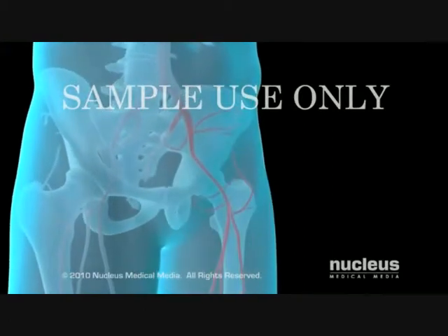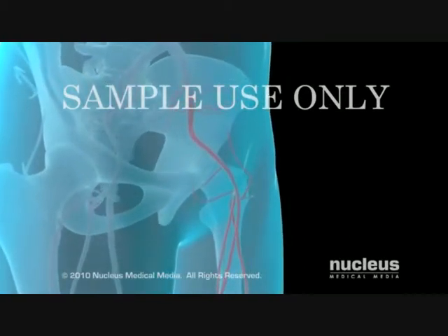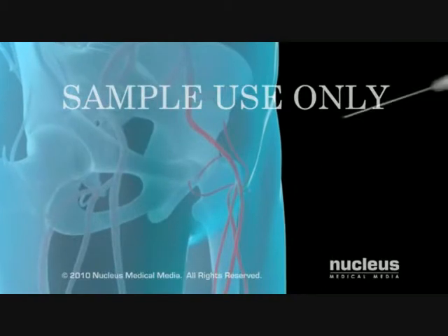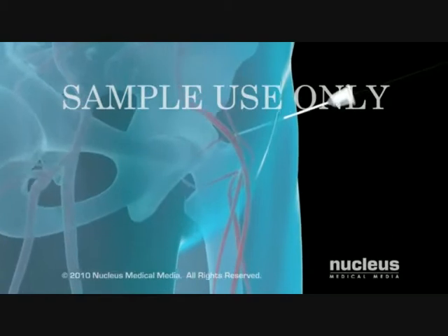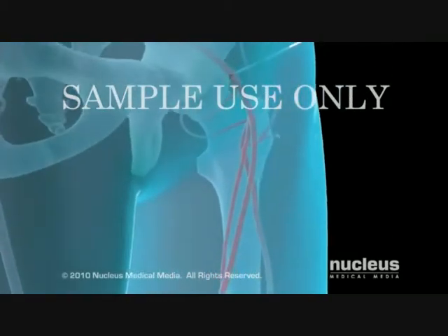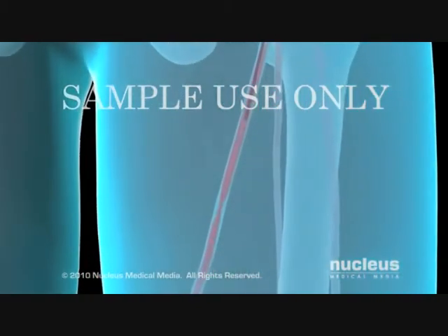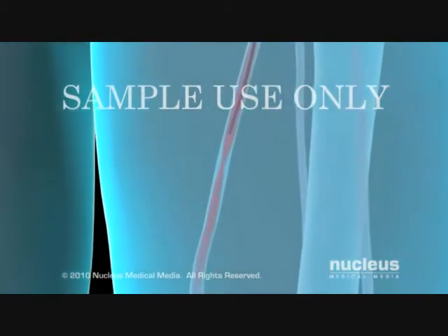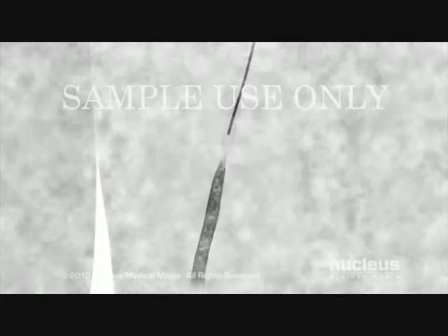Since the arteries of the leg are most easily accessed, the femoral artery in the groin serves as the insertion site in most cases. Your doctor will initially gain access to the artery by inserting a hollow needle through which the balloon-tipped catheter is passed. Watching on the fluoroscopy screen, your doctor will gently advance the catheter until it is positioned in the artery being treated and inject a special dye. This dye allows the fluoroscope to take X-ray images, called angiograms, which lets your doctor identify the exact location of the blockages.